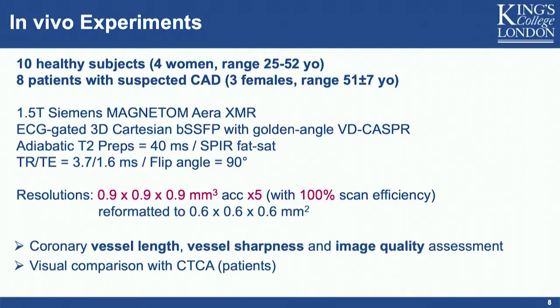We performed very conventional vessel length and vessel sharpness analysis, as well as image quality assessment. And for the patients, we compared with an additional CT contrast image.